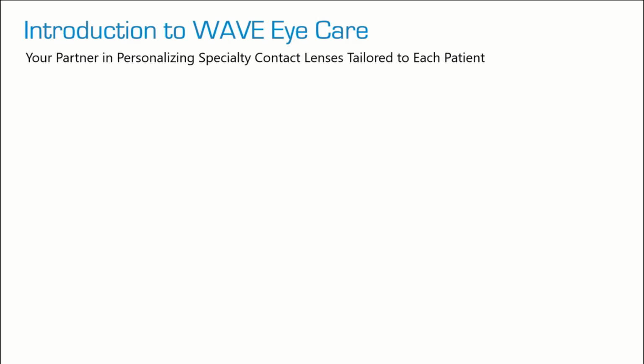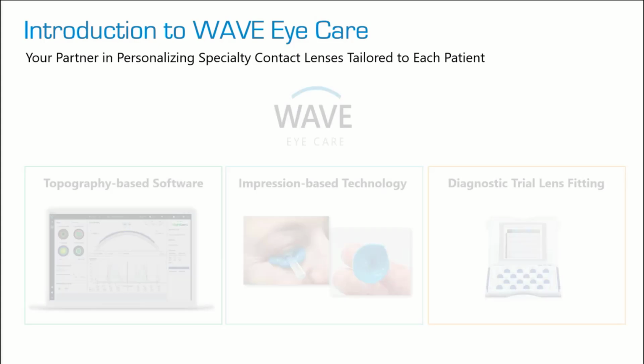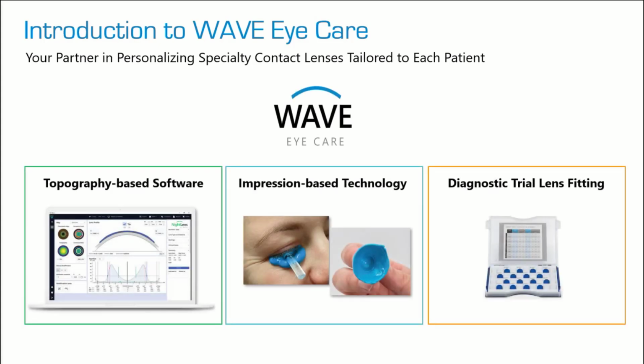Here's just a brief introduction for those of you who may be new to Wave Eye Care. We want to be your partner in personalizing specialty contact lenses that are tailored to each of your patients. And we do that through topography-based lens design software, impression-based technology, and diagnostic fitting sets.